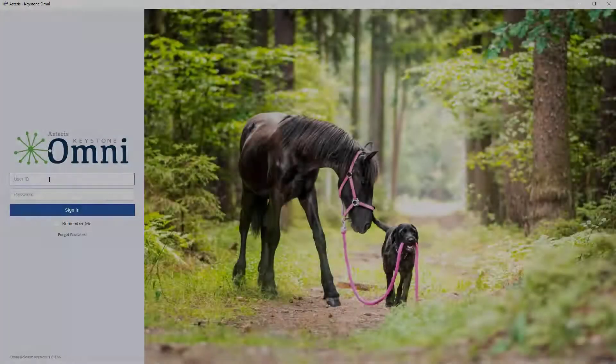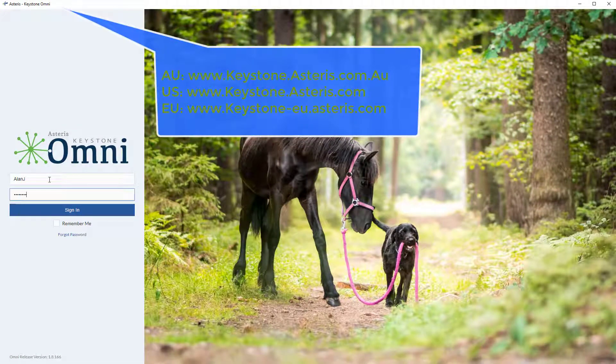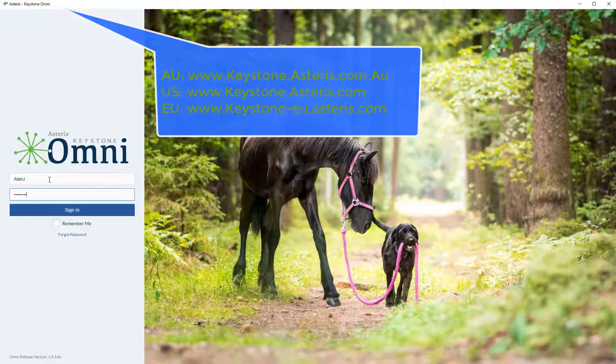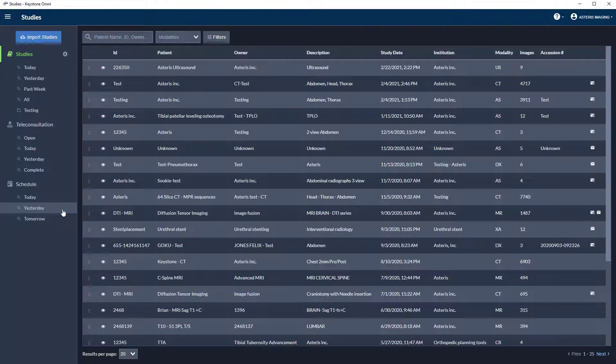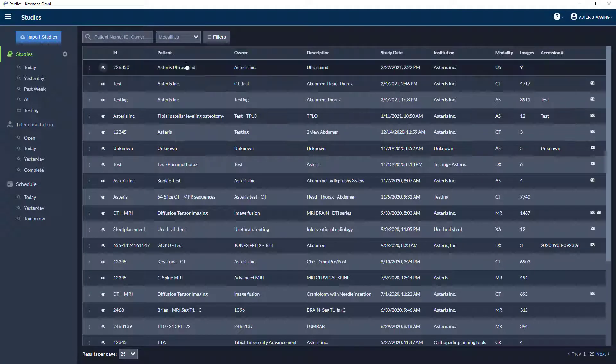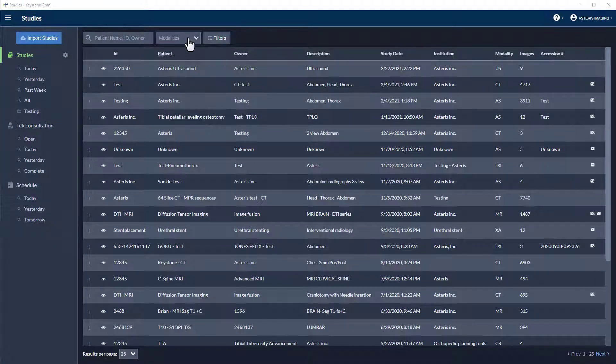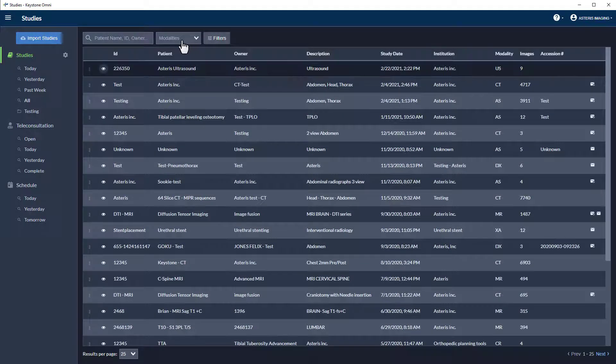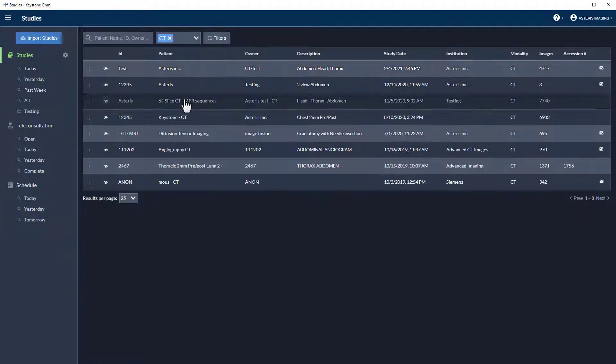To utilize Keystone multi-planar reconstruction, start by logging in at keystone.asteris.com or through the Omni desktop application. Select a CT study and open the viewing canvas.